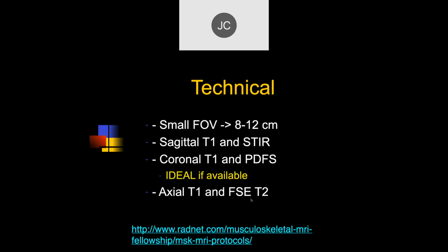And again, the planes are very important here. I like to use the standard definition of planes. That's basically in the textbook. If you stand with your arms down at your side and your palms in front of you, the plane that's parallel to the wall behind you is going to be the coronal plane. The plane that's parallel to the floor is going to be the axial plane. And the plane perpendicular to those two is going to be the sagittal plane.